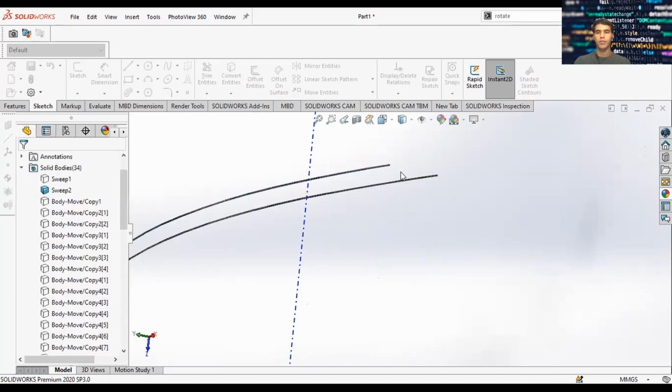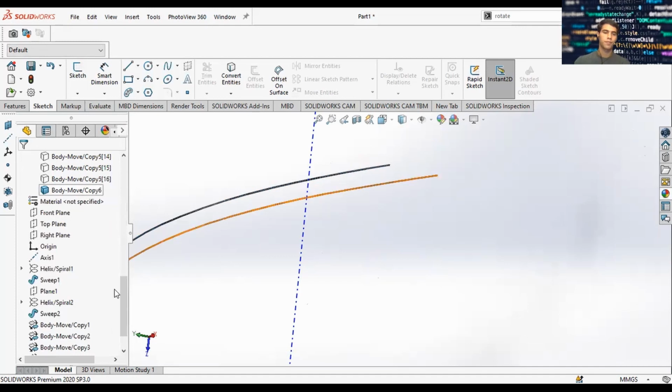Now you can see our strand is right there. For sweep 2, all the way at the bottom. Rinse and repeat.